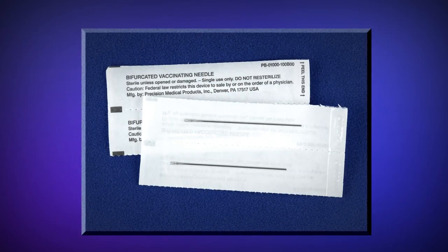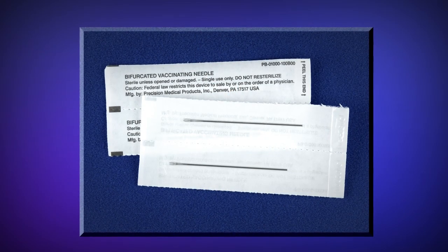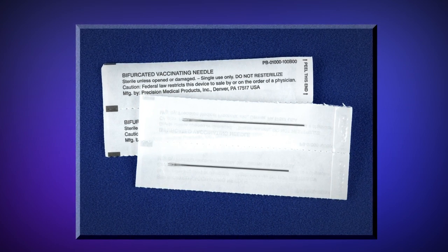In a smallpox emergency, supplies of bifurcated needles may be limited. Therefore, during an emergency, the FDA authorizes the distribution and use of bifurcated needles currently stored in the Strategic National Stockpile that are either past their labeled expiration date or that do not have an expiration date. Do not be alarmed by any expired dates on the packaging. All bifurcated needles provided — whether within, past, or without an expiration date — are all usable products.